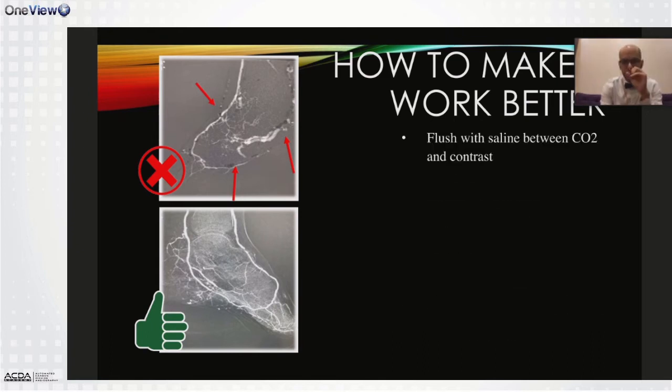Rule number 7, if you're doing contrast in between your CO2 injections, please make sure you flush your contrast out before your CO2. You have to have saline in front of your CO2 and not contrast, otherwise the image will become very ugly and you won't see very nice pictures.